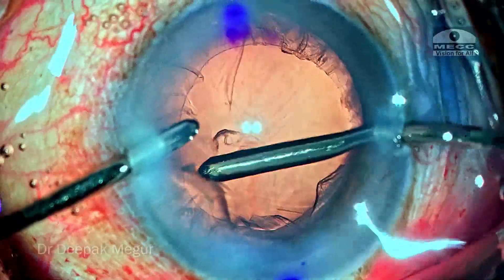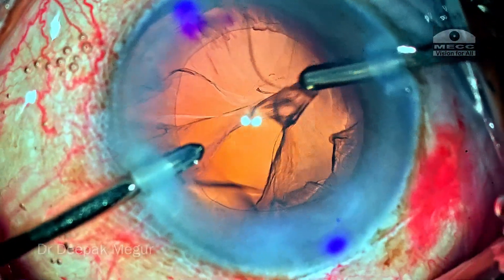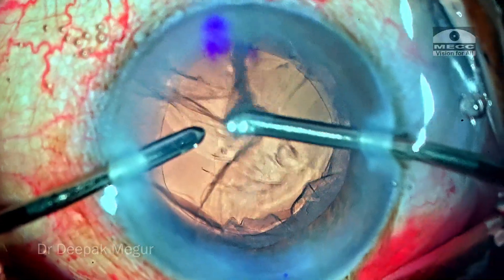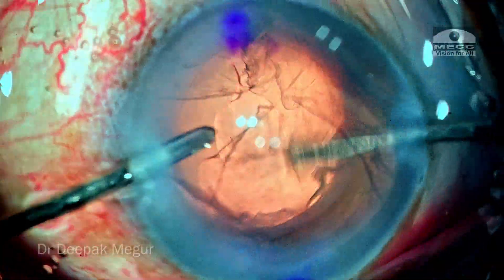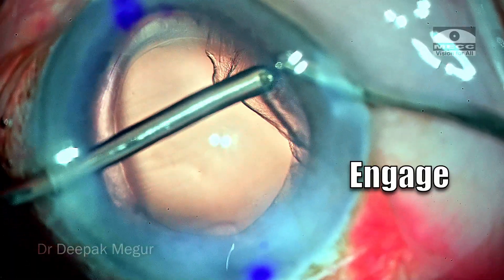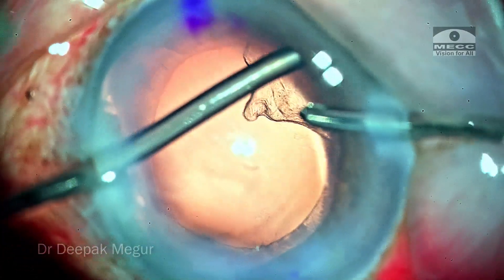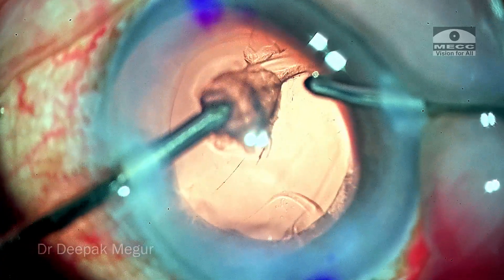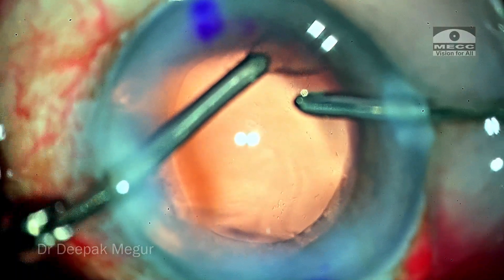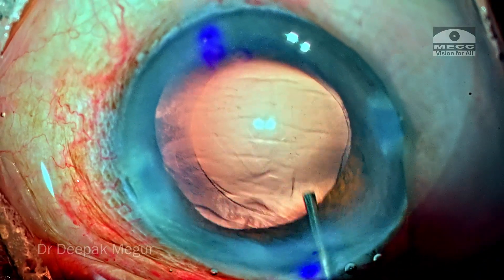During cortex aspiration, when an experienced surgeon performs the process it's quite quick. However, beginner surgeons often struggle with cortical aspiration. My recommendation for them is to divide the cortex aspiration into three parts: engage, strip, and then aspirate. Aspiration should be done in the central safe zone — this is a dictum I recommend when in your early learning phase.